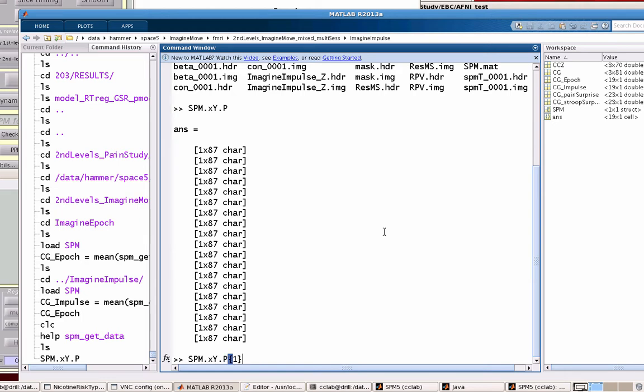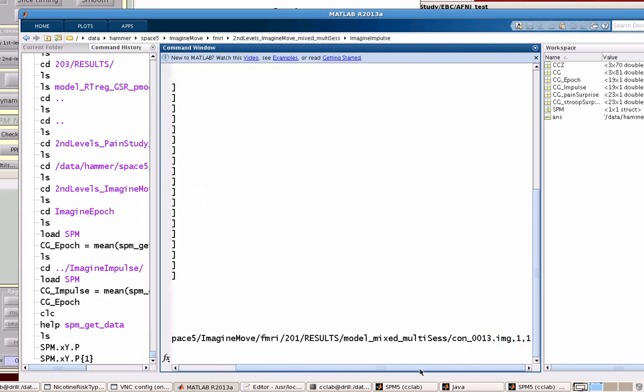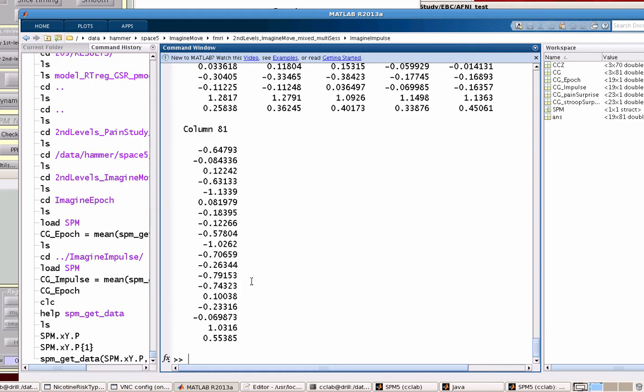For example, if I just look in one of these, it gives me a full path to the contrast number that went into this analysis. For this subject it was contrast 13, and the rest give the other corresponding contrasts for the rest of the subjects. All I need to do to extract the data from that ROI is type SPM_get_data, SPM.xY.P, and then the variable containing the coordinate information for that ROI.